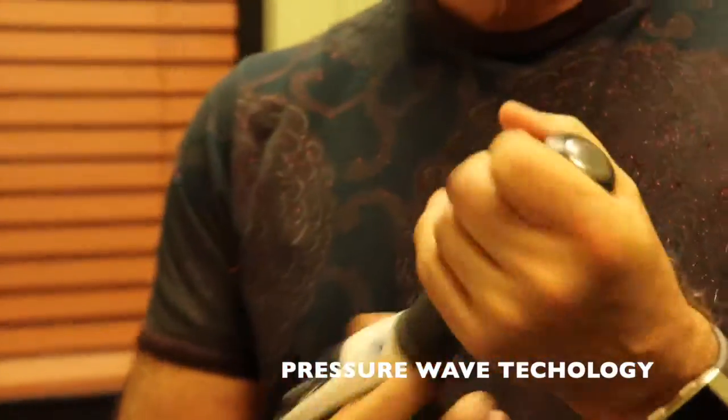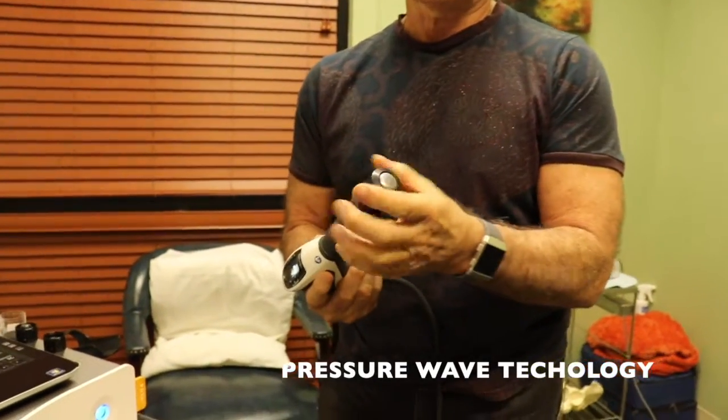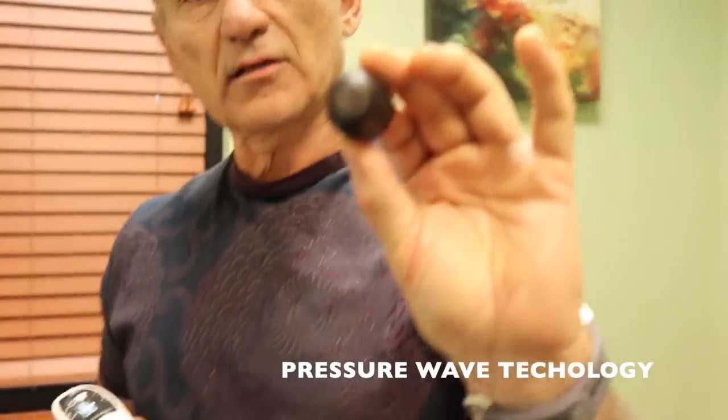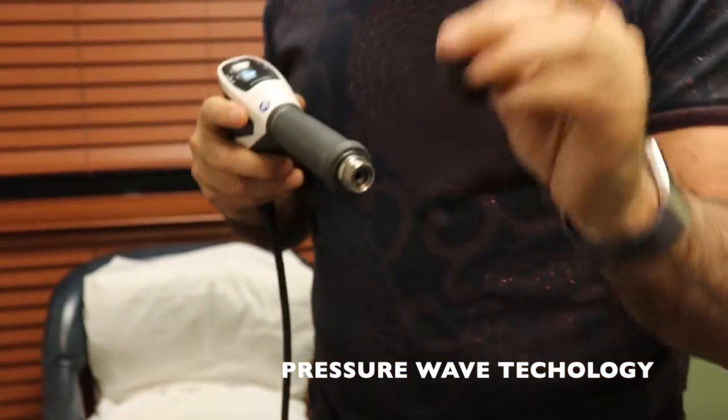And again, here is the handpiece. We can take this off. This is one that we just use for muscle trigger points. It can be used over large areas. This is a ceramic end piece, which you can see here. This one, if we attach it to this area, was used mostly for ligaments and tendons.